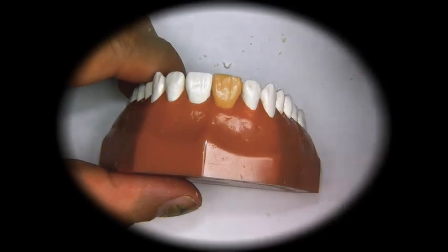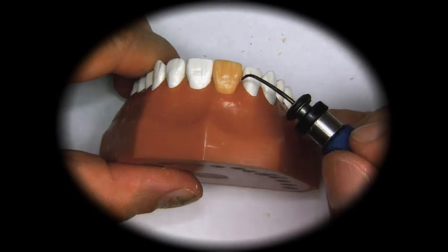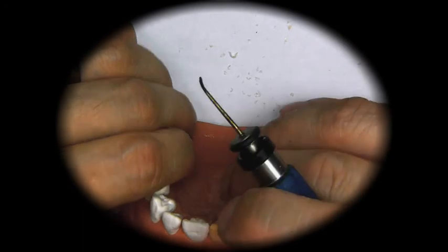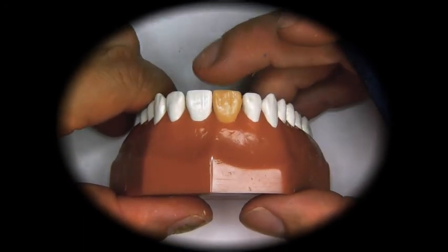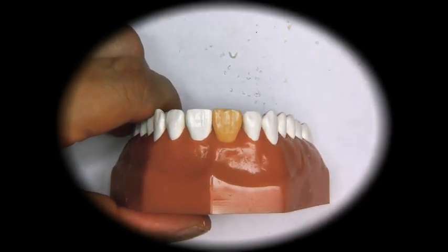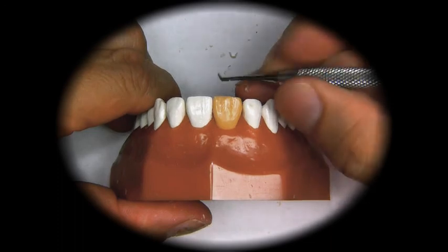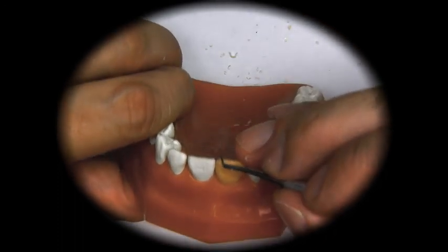And as we can see, now we have more of a convex area here. If you notice, that incisal edge here is a tiny bit long, so we're going to shorten it slightly.